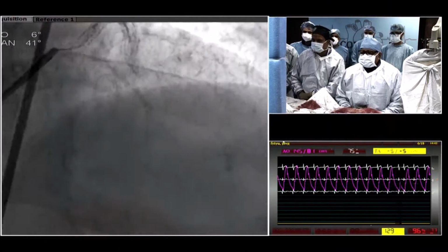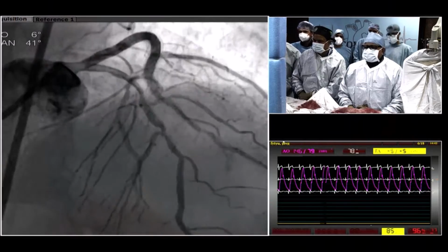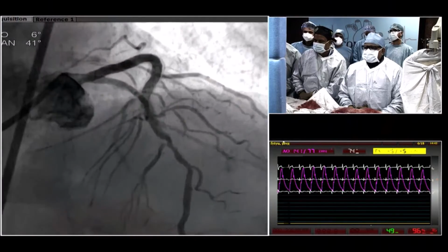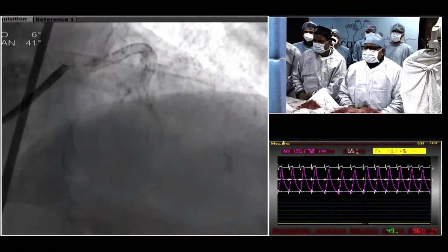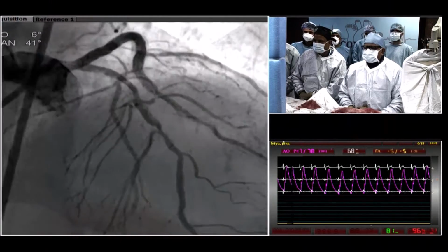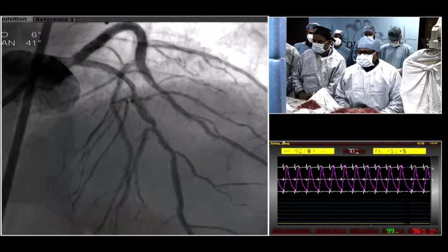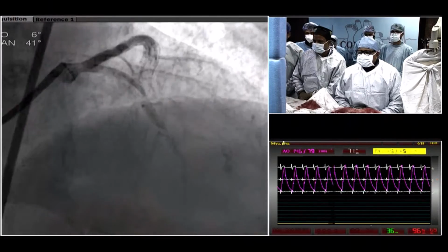Right. I think so. First thing is you put a rota, get some lumen, and then with whatever device of imaging you're comfortable with, whether OCT or IVUS, that's your choice. If I was there, I would have put an IVUS in this case. And then if rota doesn't work, then obviously you proceed on to the next stage of decalcification with IVL. So with those concluding remarks, I think you carry on with the work of cannulating this LAD with a rota wire, or conventional wire exchange to a rota wire. And in the meantime, we move on to our other lab.